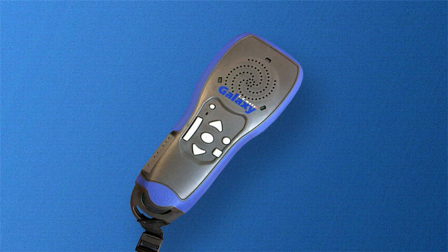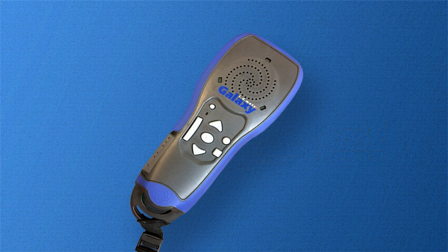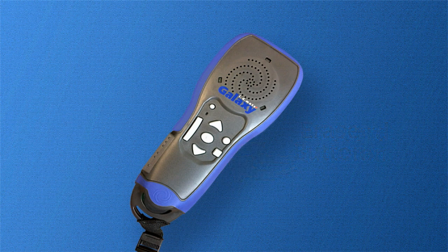The last two buttons we will discuss are the record and erase buttons. They are both located on the top right of the device. The record button is a circular button, while the erase button is a square button located below the record button. These buttons will aid us in creating our own barcode labels.